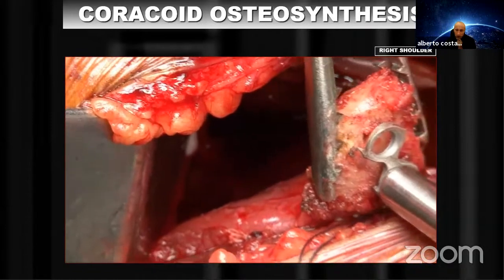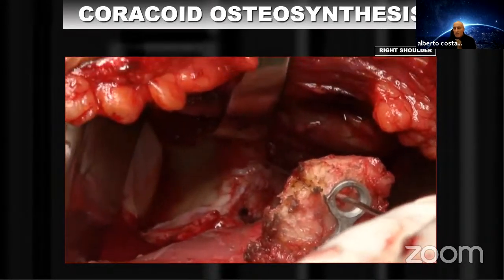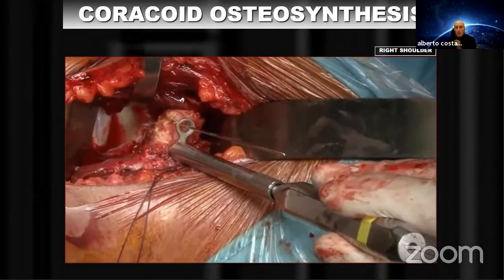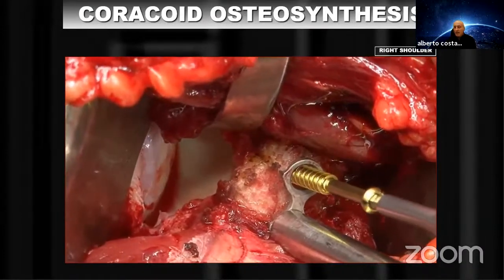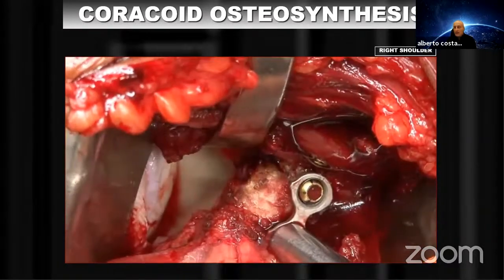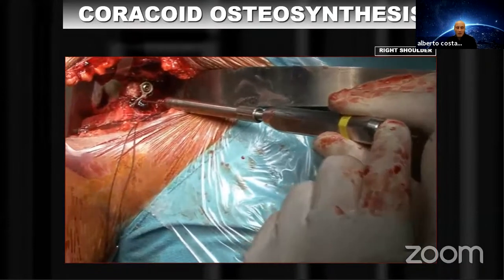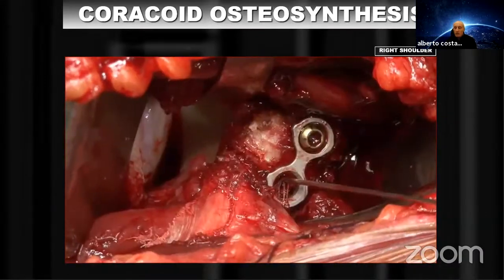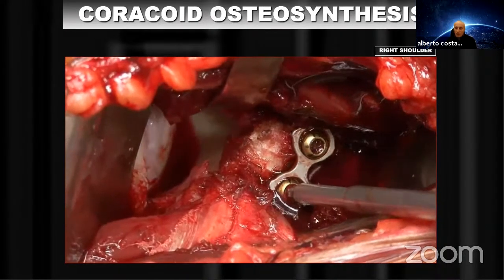You see, we have the K wire, and then we check with the K wire the hole that we have made before, with the long K wire and the short K wire, and with the joystick we push the graft to the neck. You see, we go down there without putting any fingers, and we have this device that can help us in pushing the graft down. Obviously, we have to remember to remove the K wire, because it can bend and it can be difficult to remove. And then we have all the system inside, and we go with the second screw, and the great part of the surgery is done.